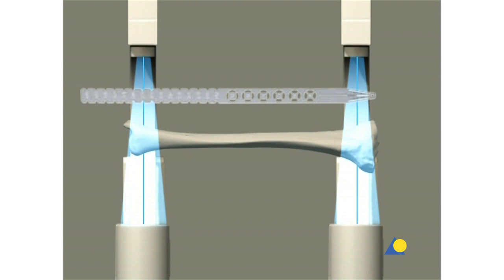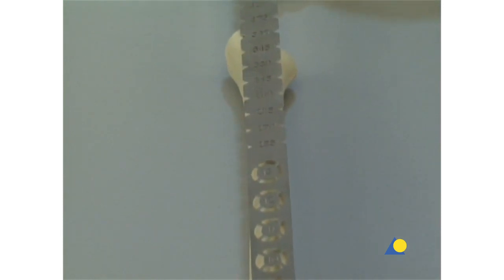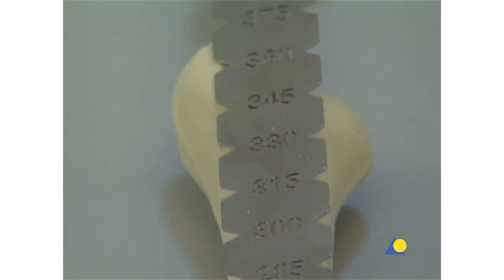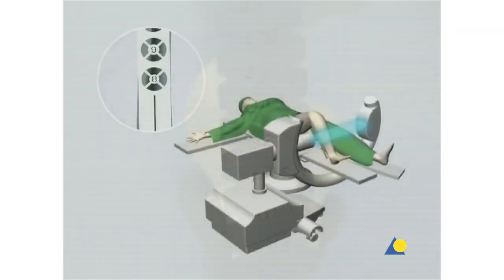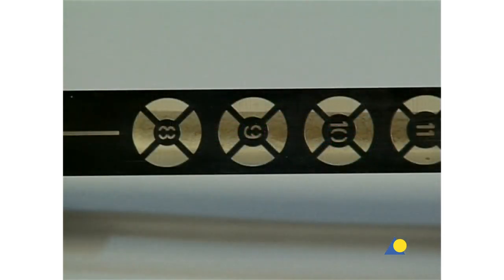The skin is marked on the lateral side. The image intensifier is moved towards the distal end of the tibia. The proximal end of the radiographic ruler is aligned with the skin marking, and an x-ray of the distal tibia is taken. The reduction is verified, and the required nail length is read from the radiographic ruler as it appears in the x-ray. The image intensifier and radiographic ruler are also used to establish the appropriate diameter of the nail.